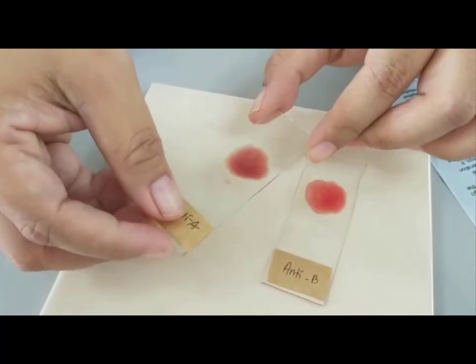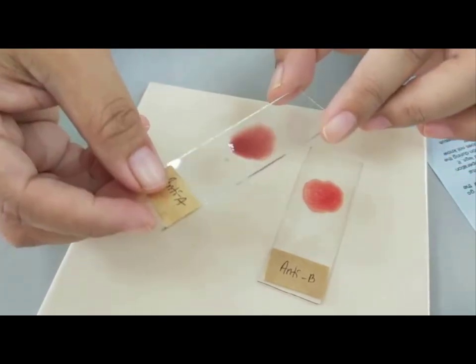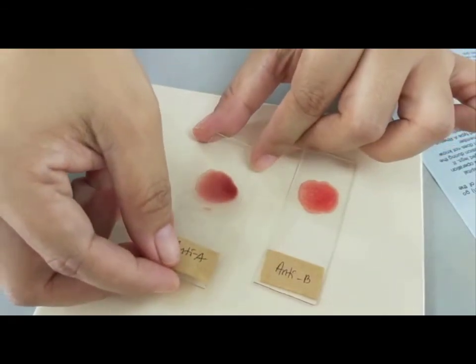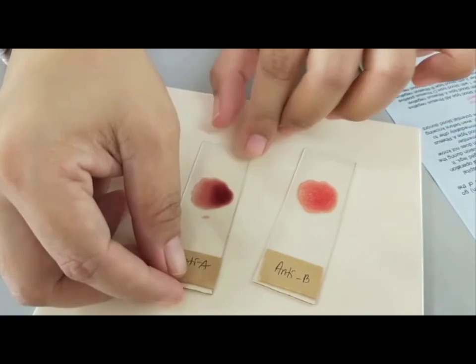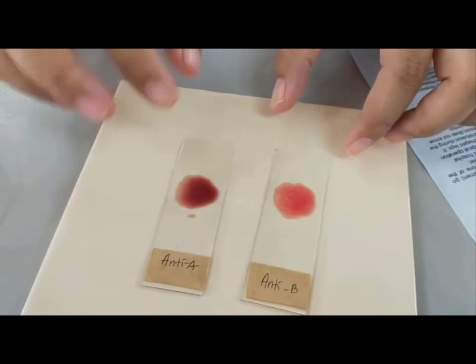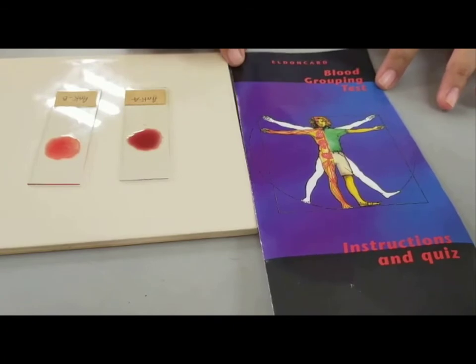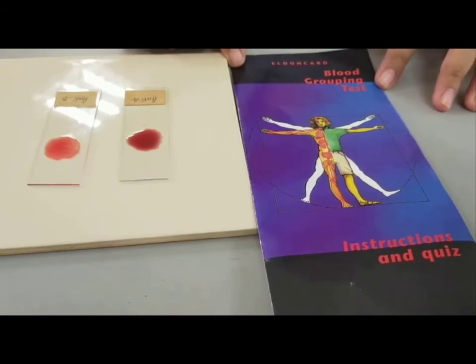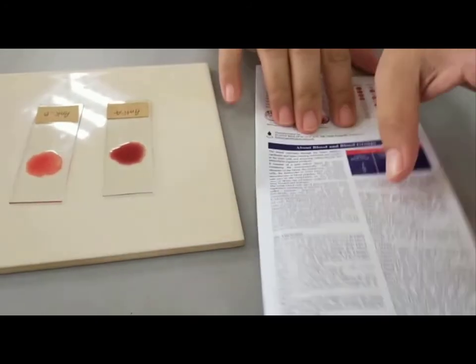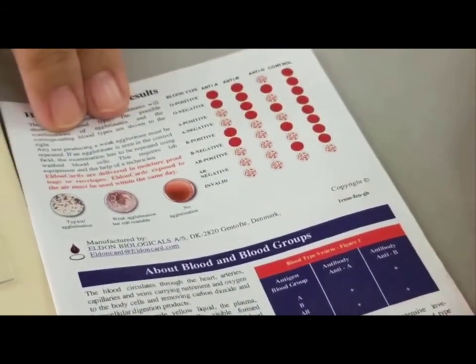Next you have to tilt the slide a few times to allow the serum to mix with the blood and leave it for a few seconds for the agglutination to happen. Make sure to do the same procedure for the anti-B slide. Next, to identify which blood group you belong to, use the provided Eldon card pamphlet. Inside has information for you to compare the possible outcomes of each of the blood groups.